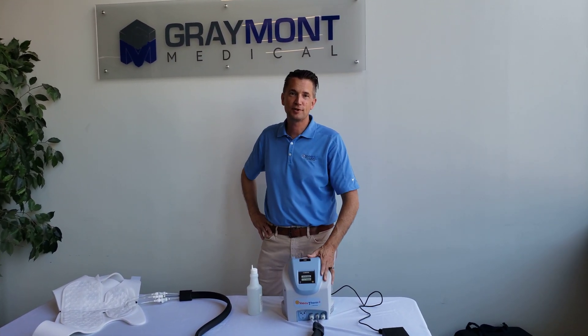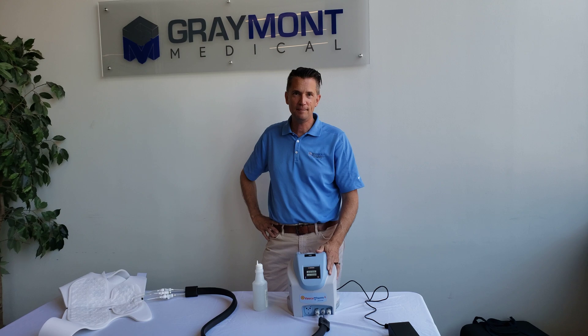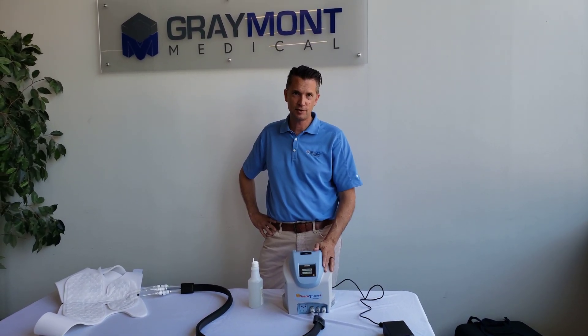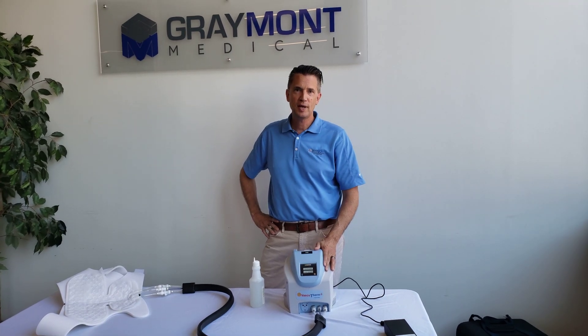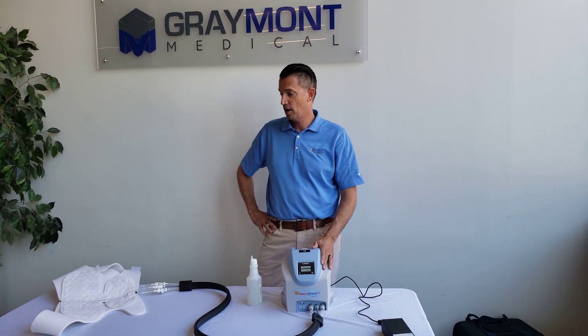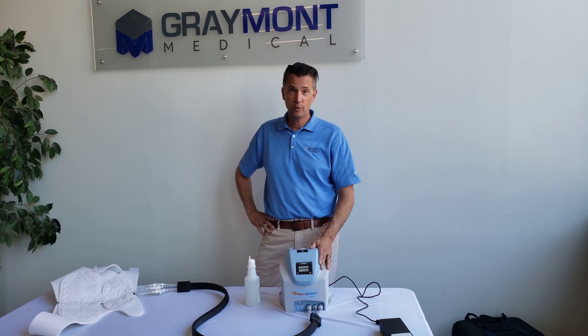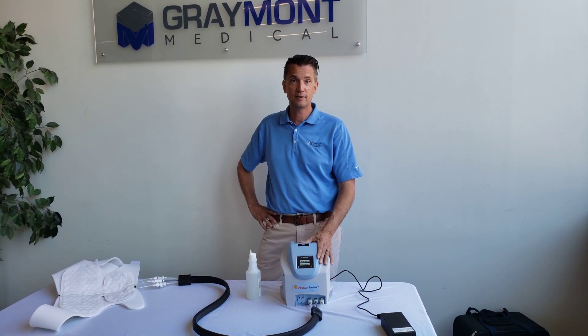Hi, my name is Steve Porche. I'm the service team manager here at Graymont. Today I'm here to talk to you about some troubleshooting tricks for the VascuTherm. Some issues we have is patients talking about it feels like it's not getting cold, so I want to go over some tricks on how to get the flow working.